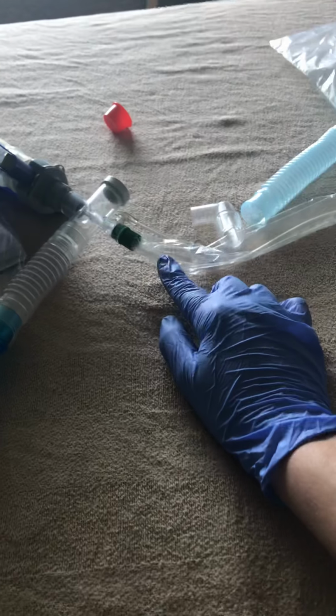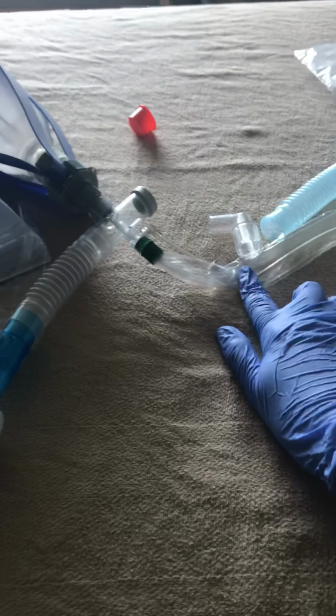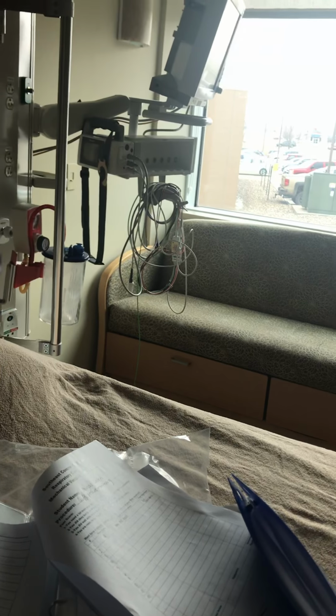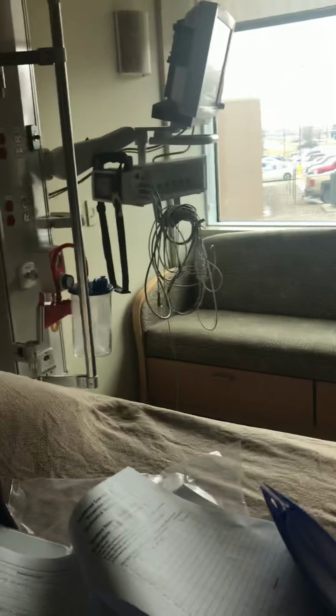While we're suctioning, we can do an assessment of what color sputum is coming out. Clear, yellow, thick, thin. We're able to document that. Then we also want to do a patient check. Listen to their breath and lung sounds. Does it sound coarse, wheezy, clear? Was this suction successful or not? We also want to monitor our oxygen. Did it increase, decrease? Did our pulse rise, fall? We want to monitor those things, especially in a critical care patient. So then we were able to document that.